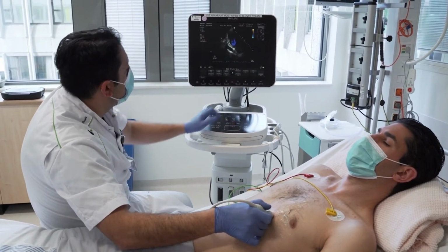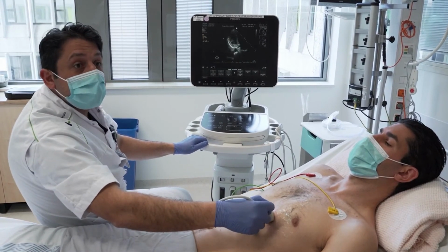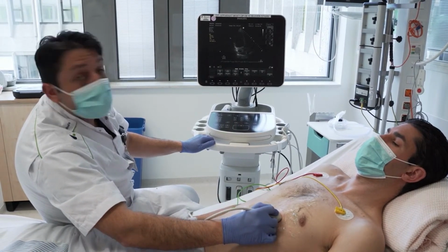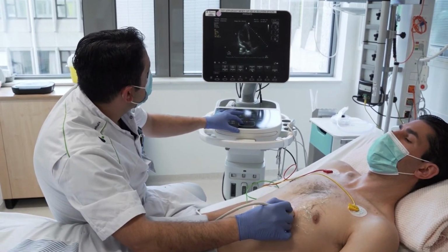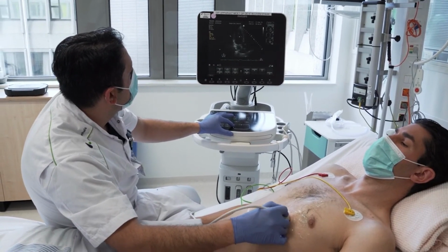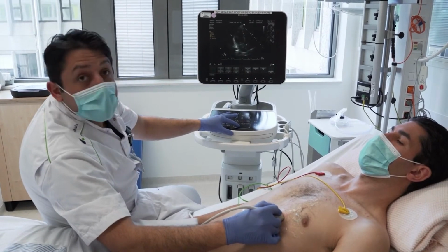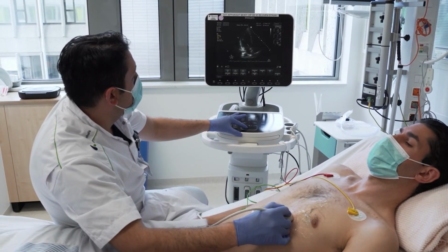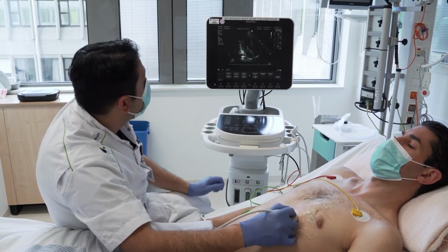And then the 3rd chamber, by turning further on to 120 degrees, you will find the 3-chamber view, and that's with left ventricle, aortic valve, and the mitral valve. So the left atrium, ascending aorta, and left ventricle in one window.